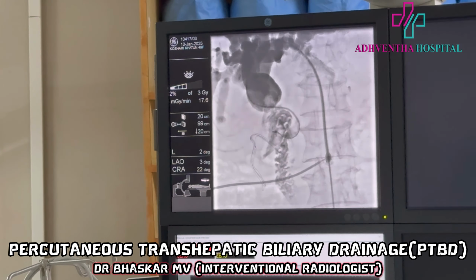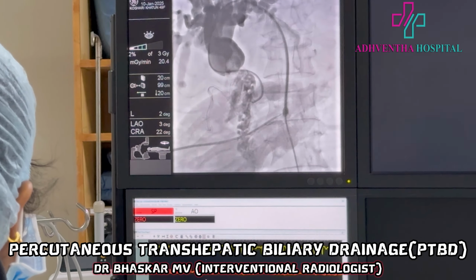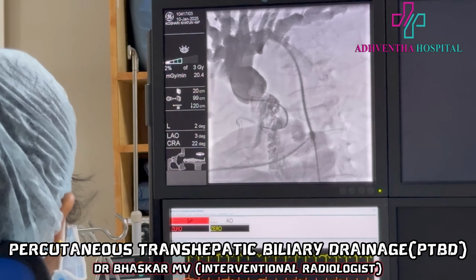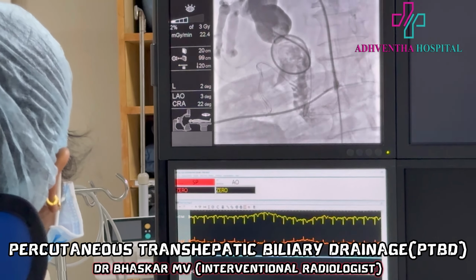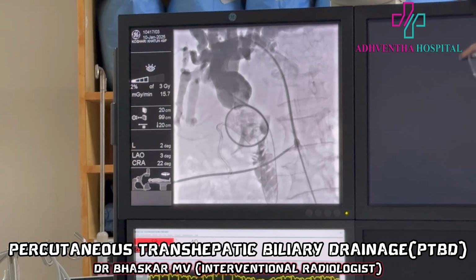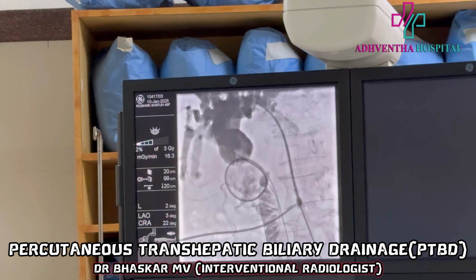Now your aim is to go into the jejunum. Jejunum it should go. See, once it goes, that's how it moves. This is the second part, the ampulla.